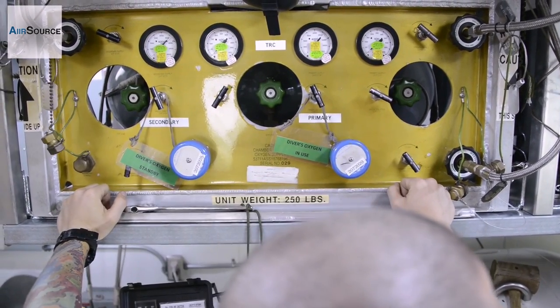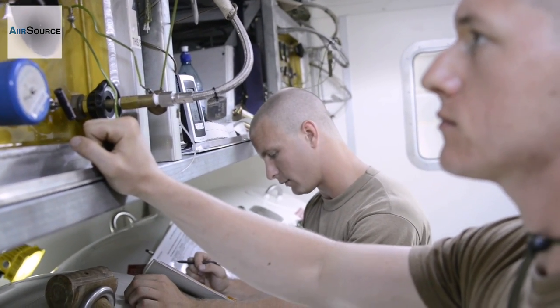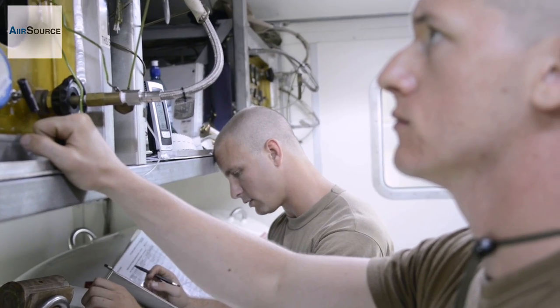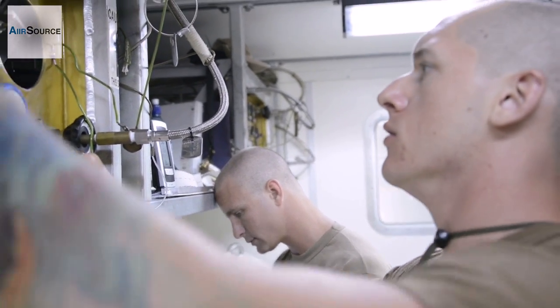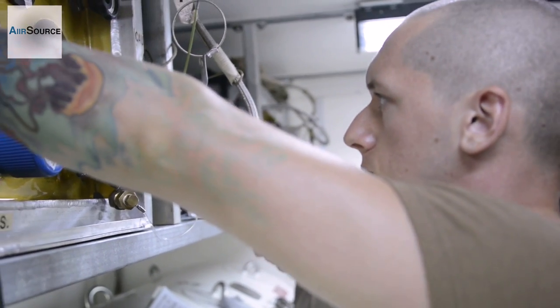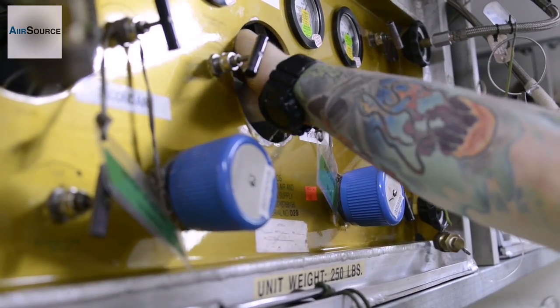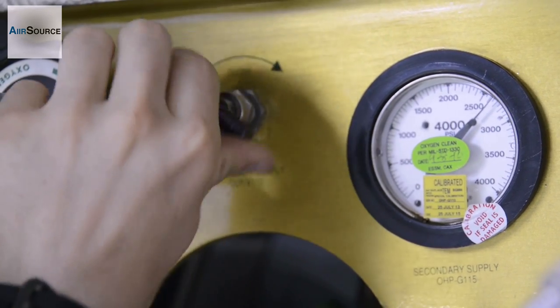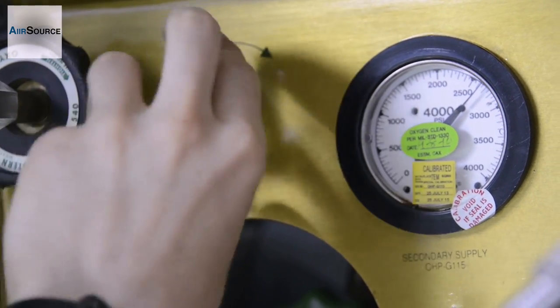Open. Primary flash stop valve OHPV105, 106, open slowly. We're checking pressure. Okay. No audible leaks? No audible leaks, Mitch. Understand.